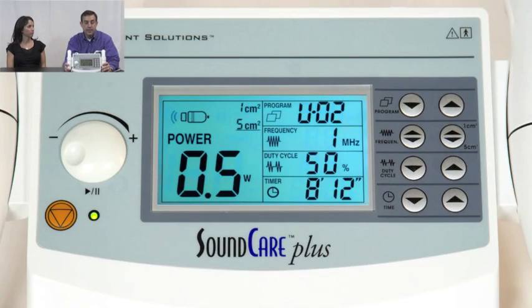Let me tell you what makes the SoundCare Plus a little bit different, and then I'll show you an application with Allison, who has a carpal tunnel injury. What makes this different is, number one, how easy it is to use — very simple. It has 20 preset programs, and it operates at both the 1 megahertz and 3 megahertz levels, for deeper or more shallow areas of the body.